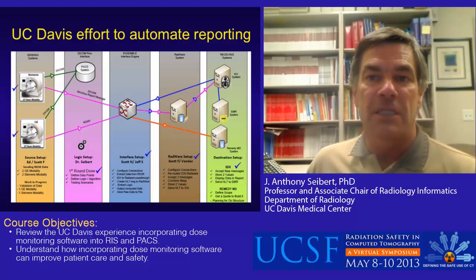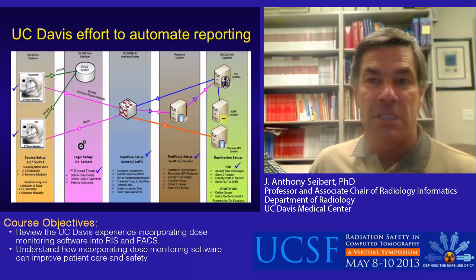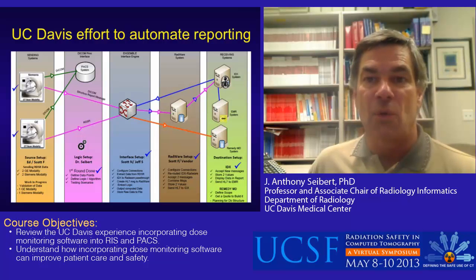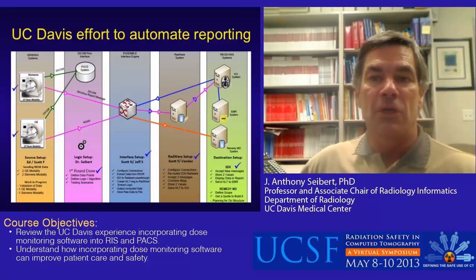From the left are the identified CT modalities that produced an RDSR. Each scanner was programmed to send its RDSR data to the DICOM HL7 interface engine. Data extraction of the CTDI vol and DLP was performed and two numbers were generated. Dose data was then sent and incorporated into a defined speech recognition template. And then the finalized report was sent to the Radiology Information System and the EMR. This effort required about 1 year of study, validation, and implementation time.